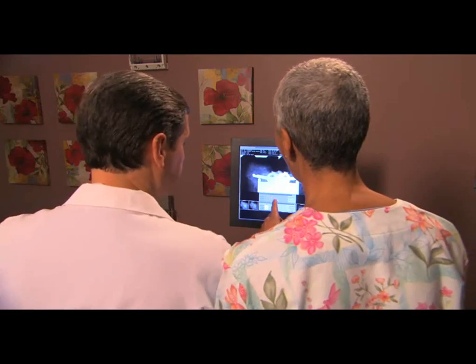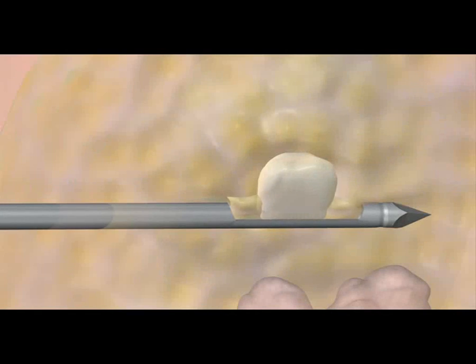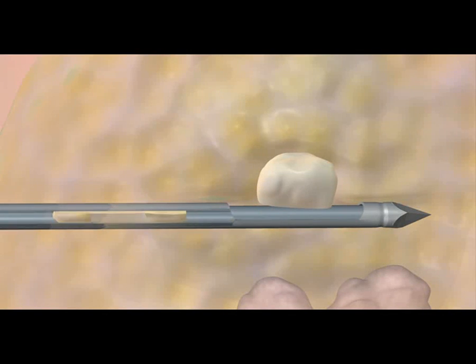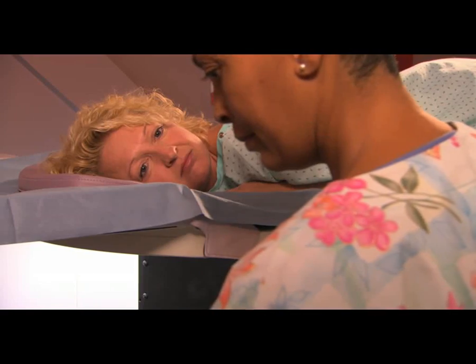They check one more set of images to make sure they've reached the area of interest. Vacuum pressure is used to take out the sample, flushing the area with fluid at the same time. They take a few samples to make sure they have enough tissue for diagnosis.